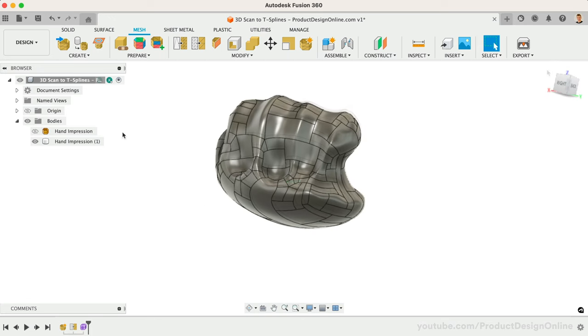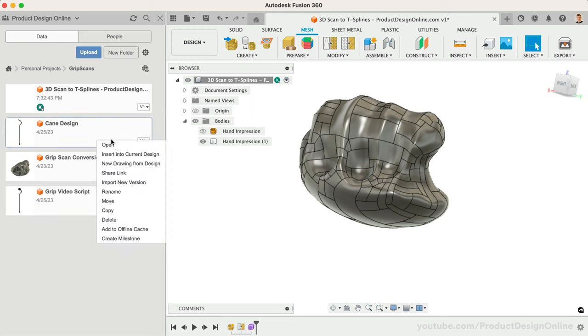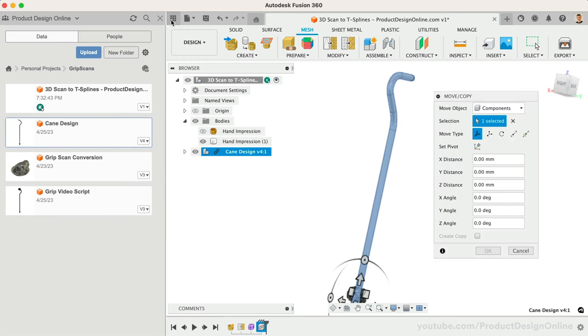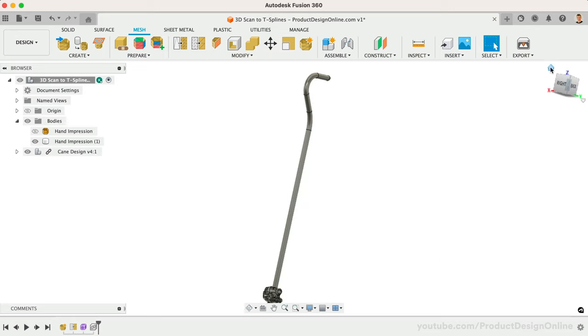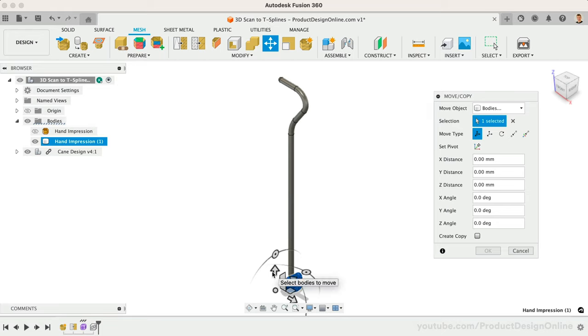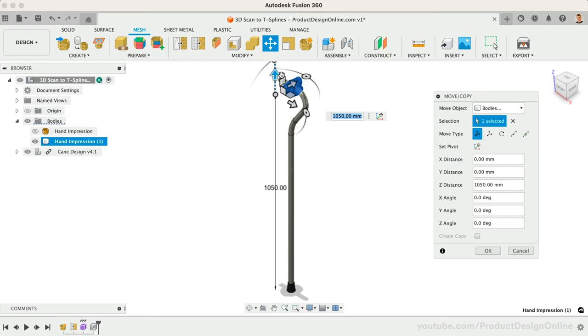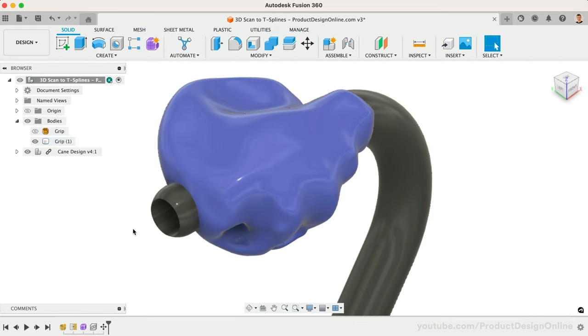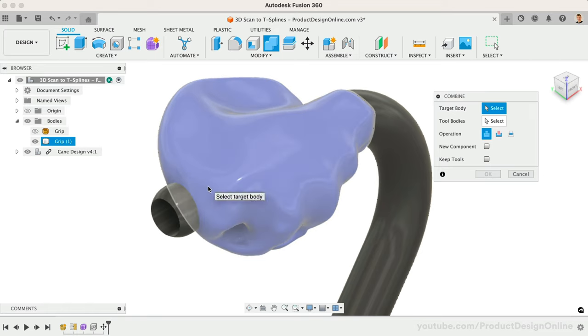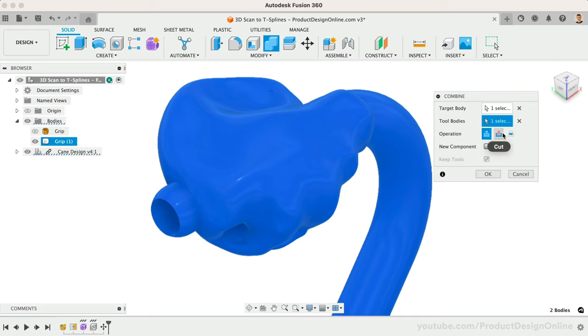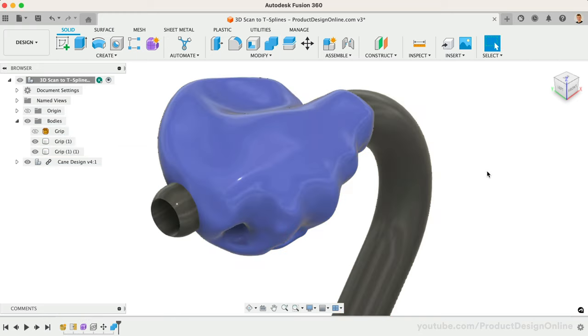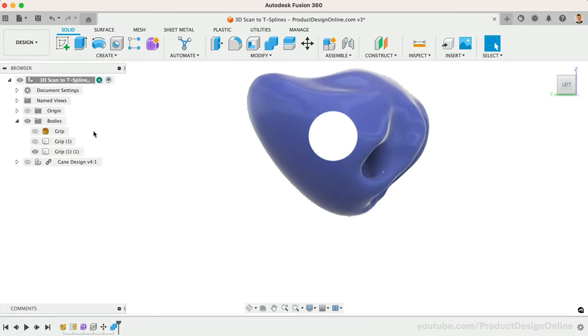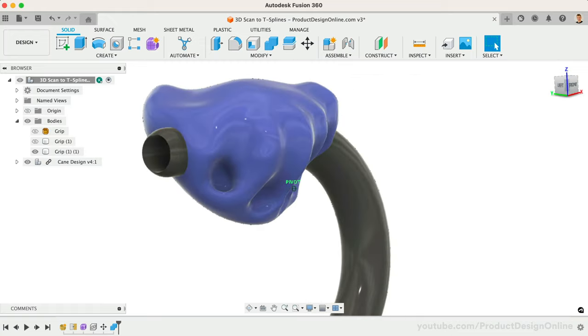To finish off this model, I'll insert the basic cane design that I previously created. I'll use the Move command to position the existing T-Spline body into the desired location. Once in place, we can use the Combine command to cut out the pipe diameter from our grip body. I'll change the operation to a Cut operation and make sure Keep Tools is checked as we want the cane body. You'll see that our grip now has the appropriate hole running through it, so we can manufacture the custom grip for the patient.